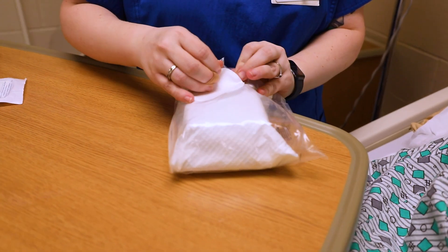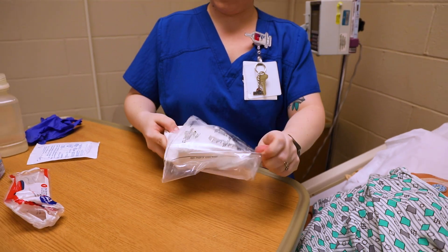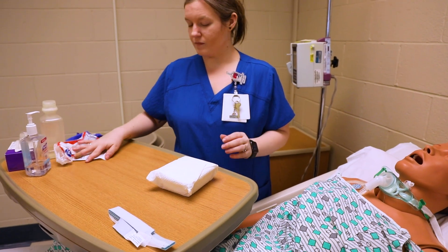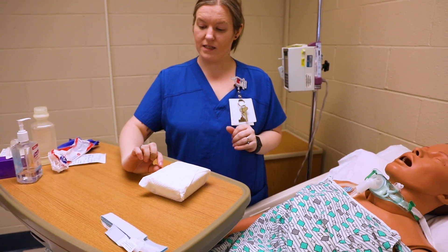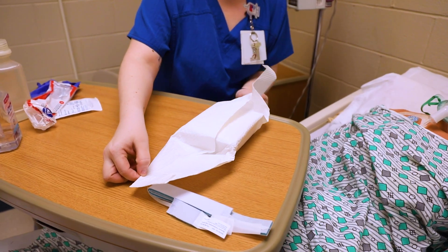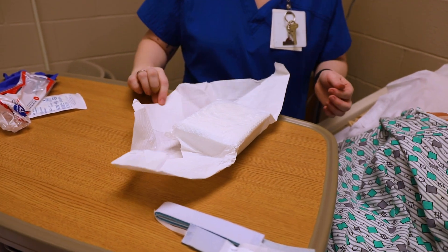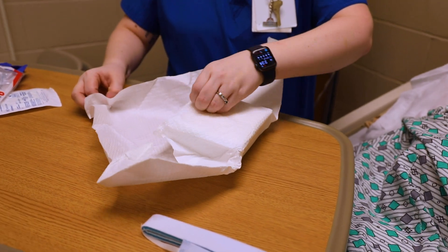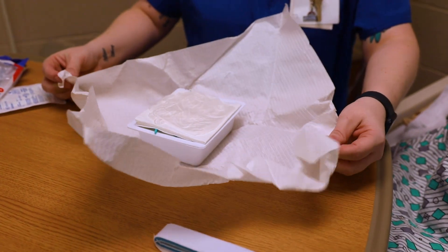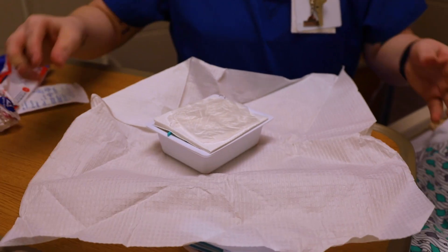While that's working, I'm going to open my kit. As with every sterile skill, the tray needs to be nice and clean. You're going to open your first flap away from you and your second flap towards you. Sometimes they don't want to open up easily. Remember you have your one-inch border, so as you open you might have to kind of pull and tug — but maintain that one-inch border.